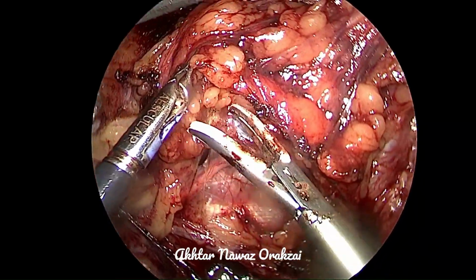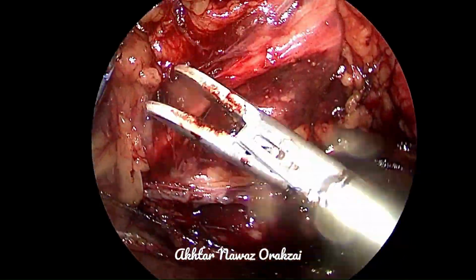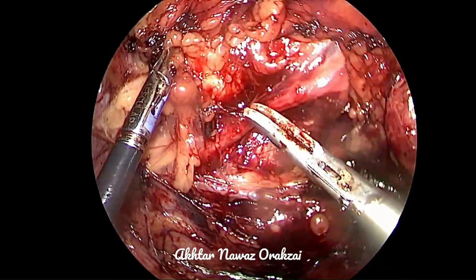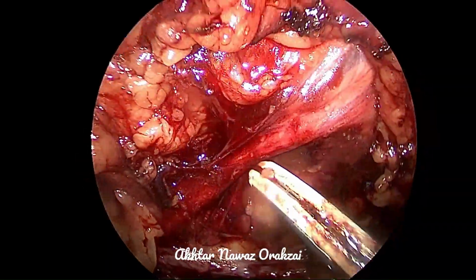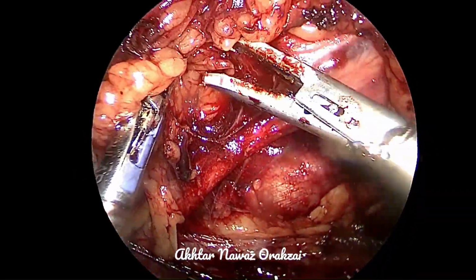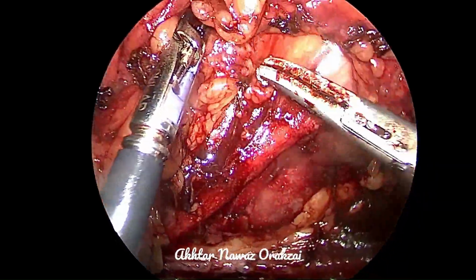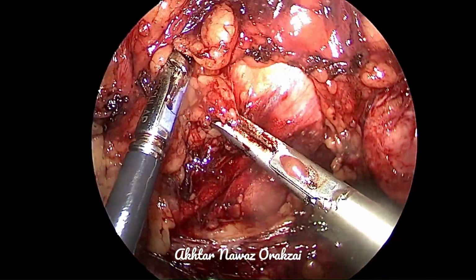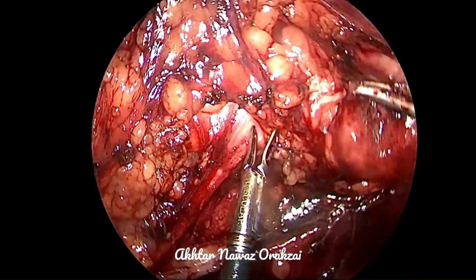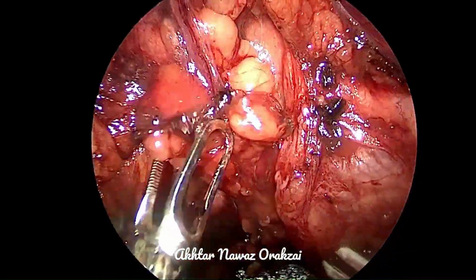Here you can see that we have identified the ureter, and it is doing its peristaltic activity, and we have to preserve the blood supply. You can see small vessels crossing here and there, but we are coagulating those vessels away from the ureter, preserving the small vessels which are running longitudinally along the ureter within the periureteral sheath.